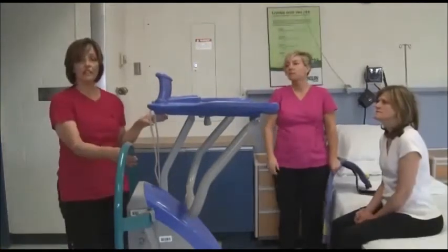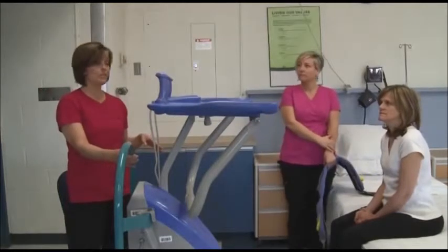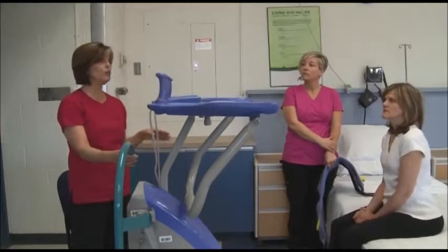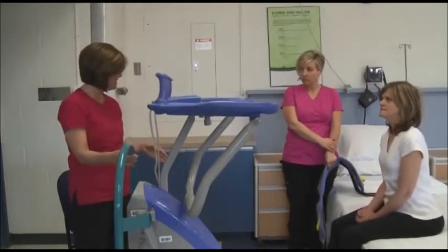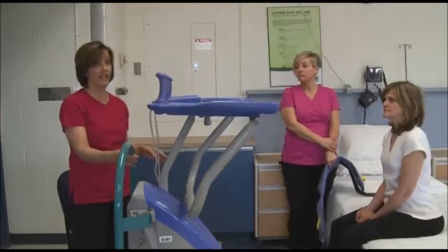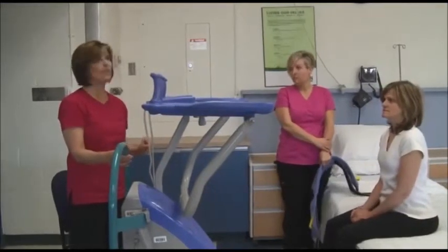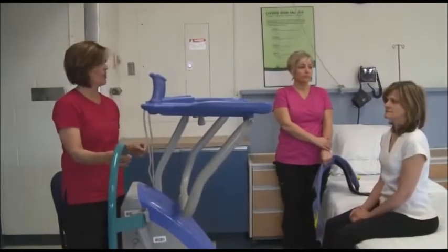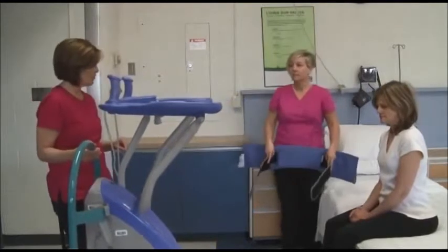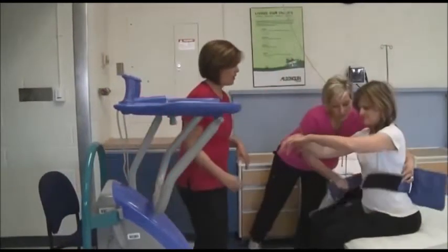The Sara lift, or the Encore lift that we have here today, can only be used with clients who are able to understand simple commands and who are able to bear weight on at least one leg and are capable of sitting independently without somebody else supporting them. Okay? So the first thing we're going to do is ensure that we put on the safety belt around Carmen.